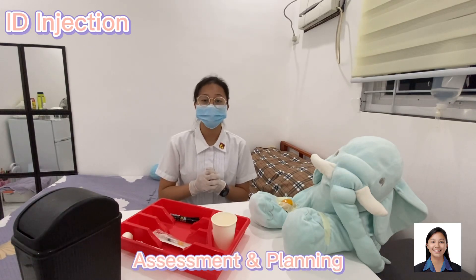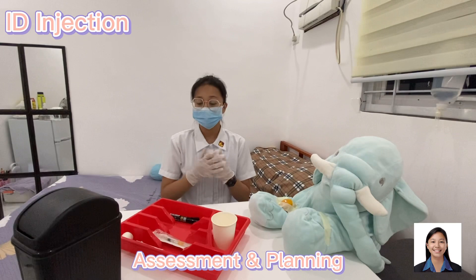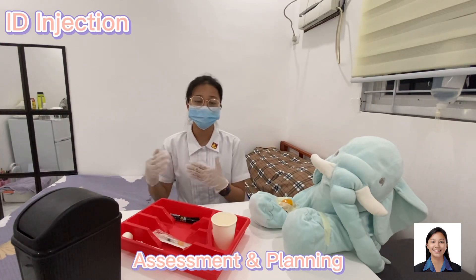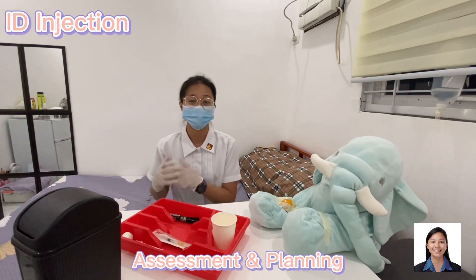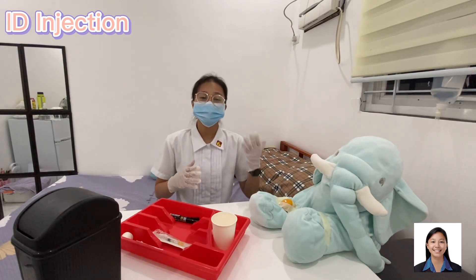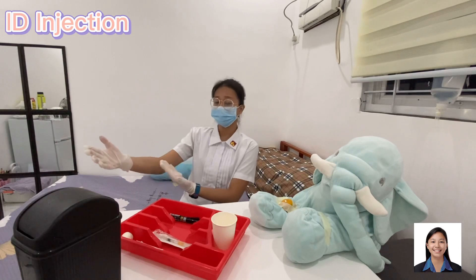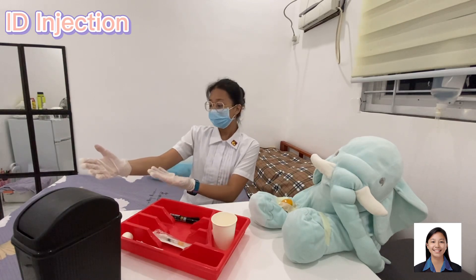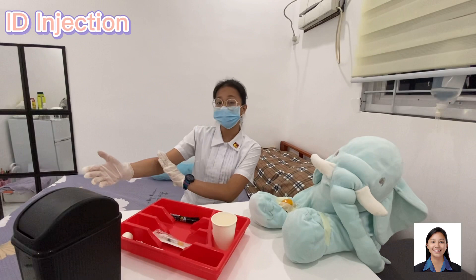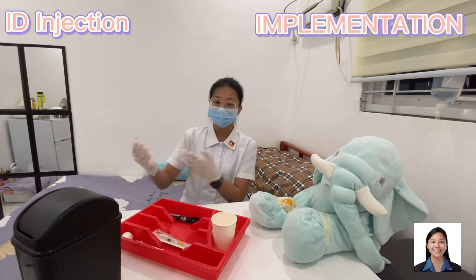Prior to this, I already performed hand hygiene and gathered all the necessary materials needed, then checked them with the medication administration record. In doing intradermal injection, the common site is the lower arm, just below three to four fingers from the antecubital space.